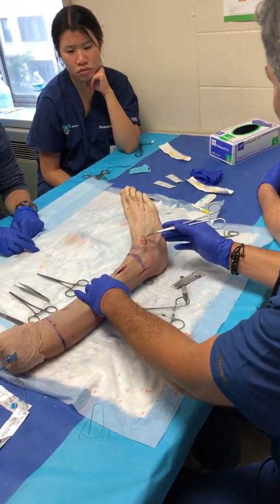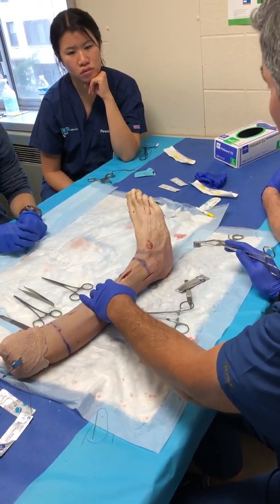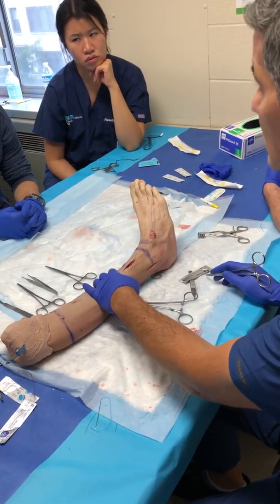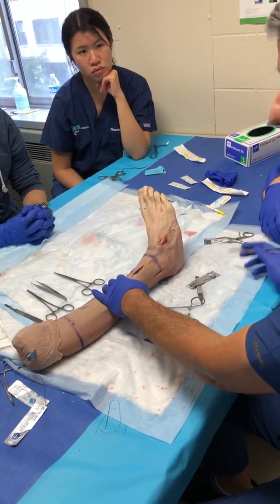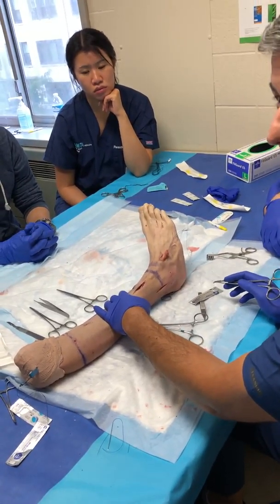If you have the biotenodesis screws, they work great. But in osteopenic bone, an interference screw is the way to go. This is what you use for ACL reconstruction. It has a big bite. Have you ever seen those? Google them. A biotenodesis screw from Arthrex, that is the most common use, and an interference screw for ACL.